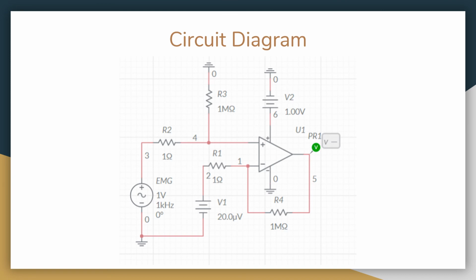Positive data will only be present if there is sufficient muscle movement present. During REM sleep, there should not be lots of muscle movement because the body releases paralyzing chemicals to inhibit muscle movement during REM. This circuit contains a large gain, but since the op-amp is saturated at 1 volt, the positive data will be maxed out at 1 and the negative data will be set to 0.